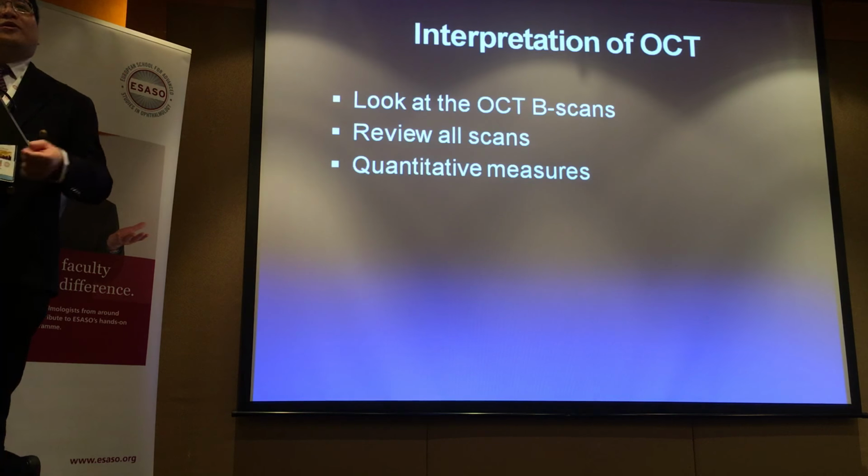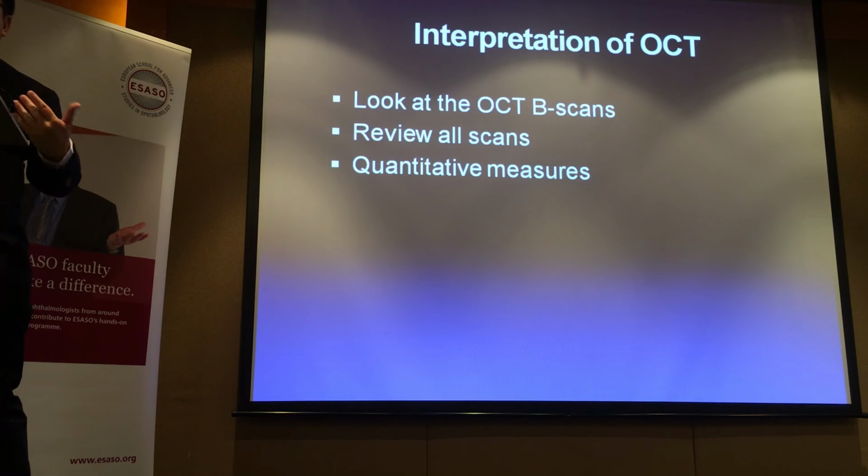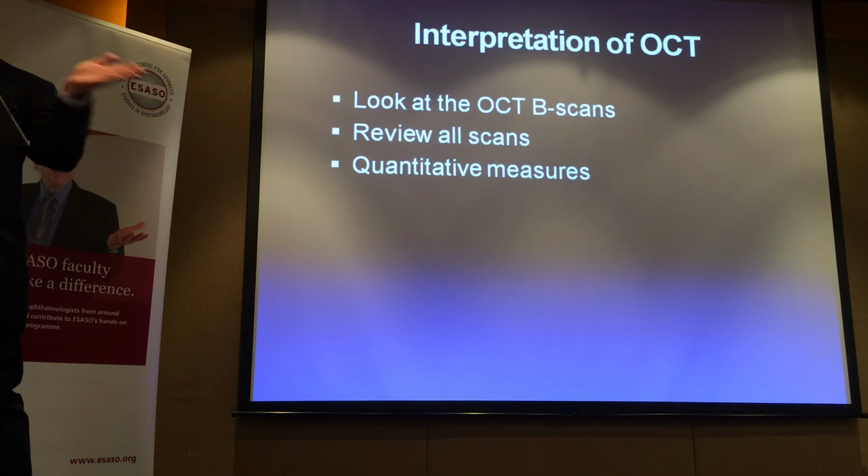Actually, the joke is that for retina, we just want the cornea to be clear enough so we can see the back. But still, look at all the structures. We're doing this instinctively, whereas a beginner will be saying, remember, check the conjunctiva, check the eyelids, check this, check that, right? But we're just sweeping through, isn't it?